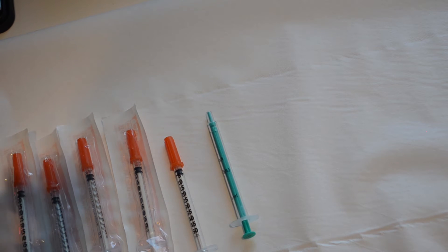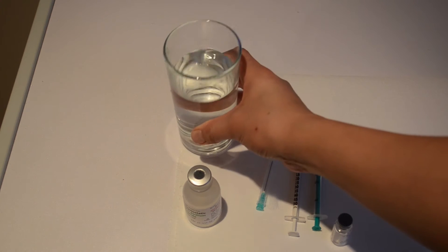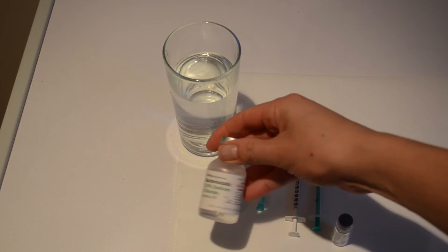Now we're not going to send these out in the post to your bacteria static saline. What I want you to get at home is if you could get a glass of water that can mimic your bacteria static saline.